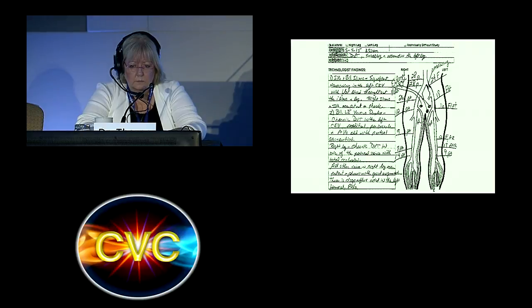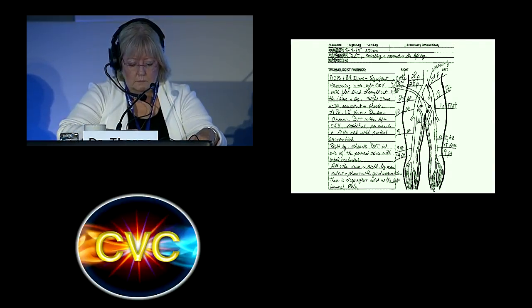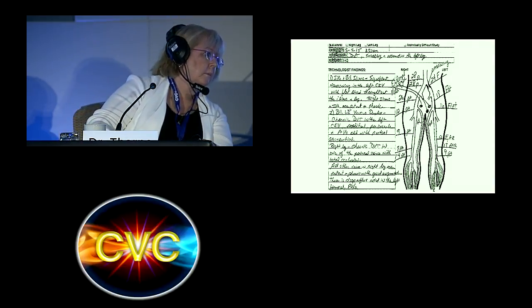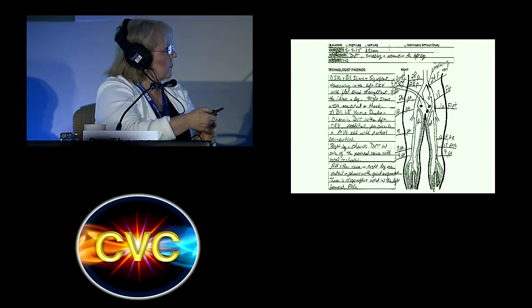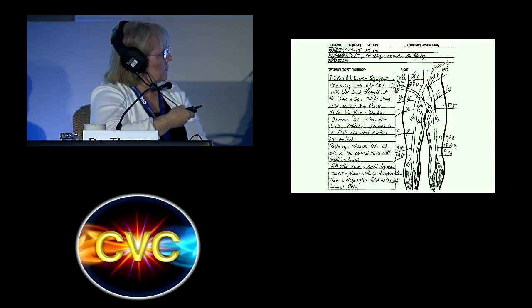Now, this is his ultrasound. There are actually some chronic changes on the left side, starting from the iliacs all the way down. It has apparently either recanalized or everything that was there went up into the pulmonary artery, but there are some chronic changes at the level of the common femoral. Apparently there's something at the common iliac vein as well. Some of the tibialis are occluded. So what we're dealing with here after 8 months is a chronic deep vein thrombosis.